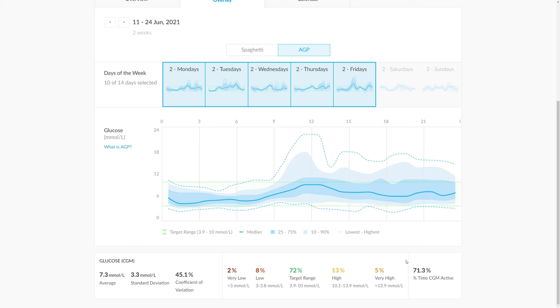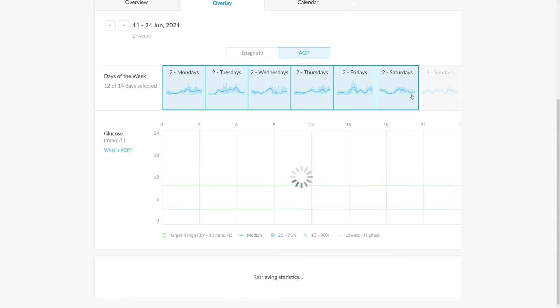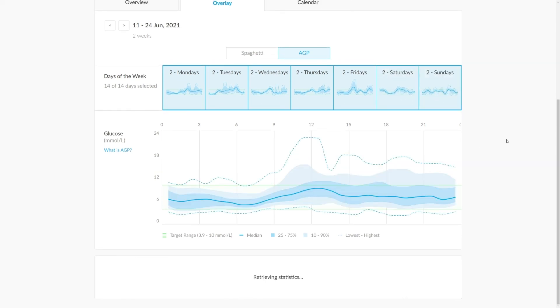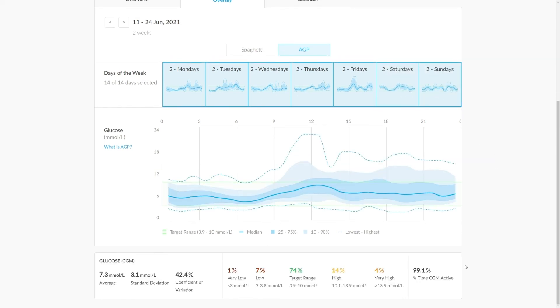And those brackets are defined below. You can also see the percentage of time that the CGM was active within the days that we have selected above. As we select more data, these figures will adjust.